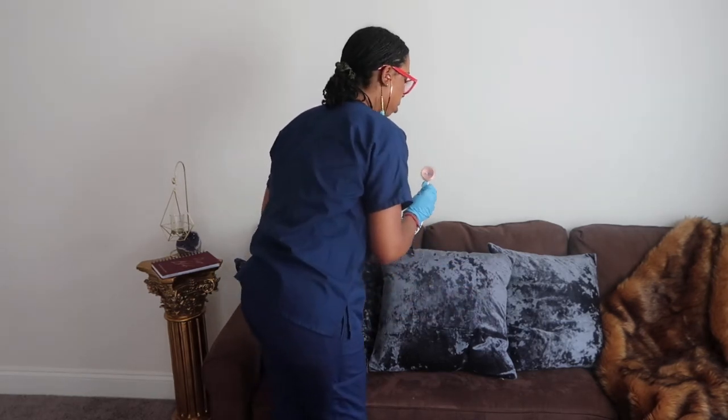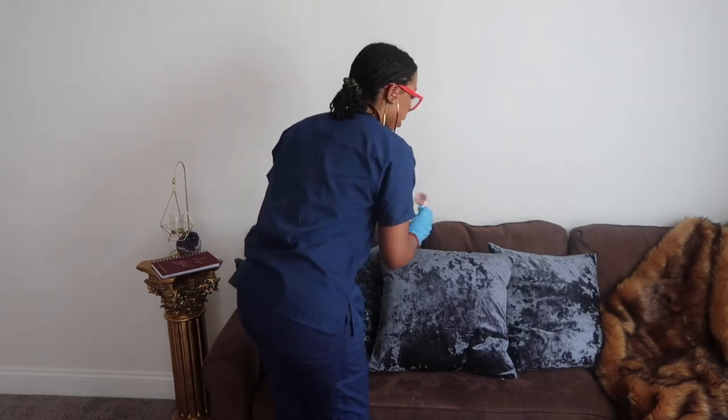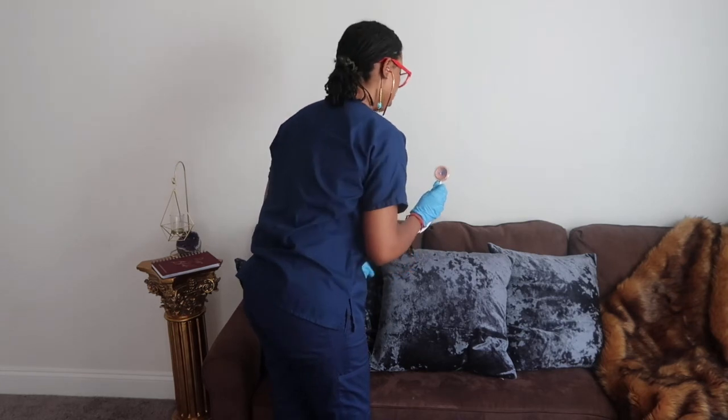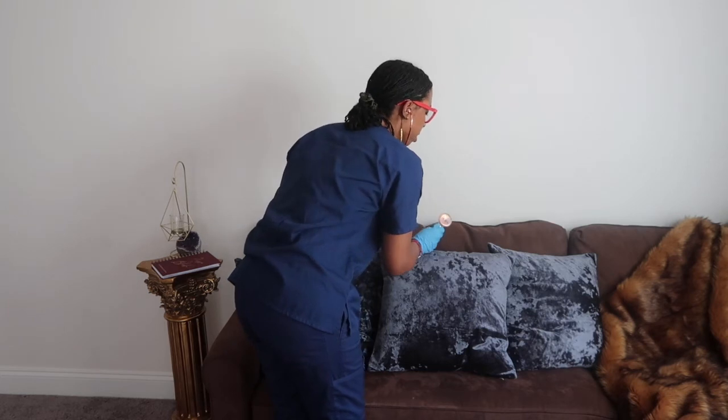I'm going to have you turn your head to the side. I'm going to listen to your carotid artery to make sure there are no bruits. I'm going to have you hold your breath while I listen with the bell. I'm going to do the same on the other side — hold your breath while I listen to your carotid artery to check for bruits on this side.